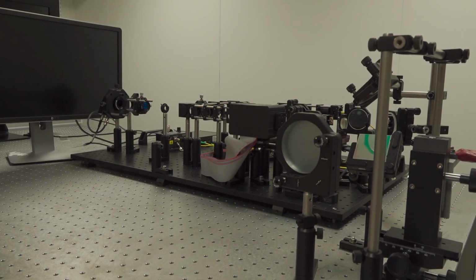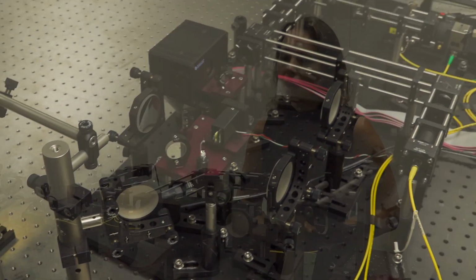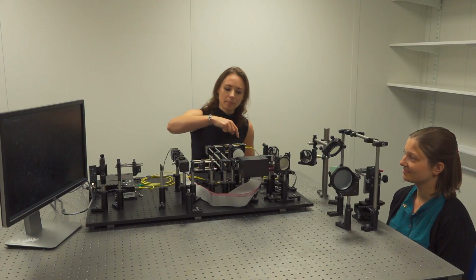We want to image cells in the living human eye. We want to be able to see individual cone cells by looking into the eye. Here in the lab, we've built a special microscope for looking at the back of a participant's eye. But unlike a traditional camera, we don't take a picture of the entire retina all at once. Instead, what we do is we focus a laser beam into the eye.